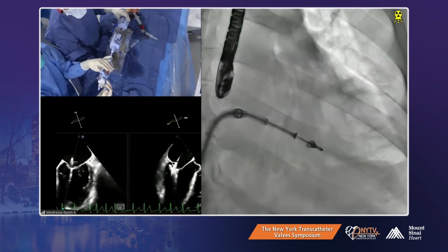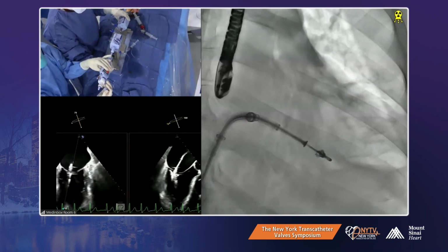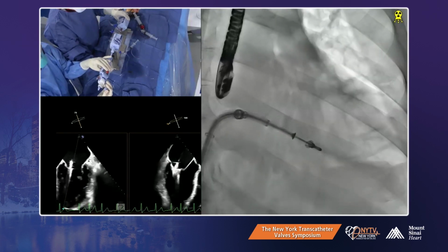You're getting a grip, a lot of posterior. You need to get more anterior. So you need to go counterclockwise in your guide. That's better.